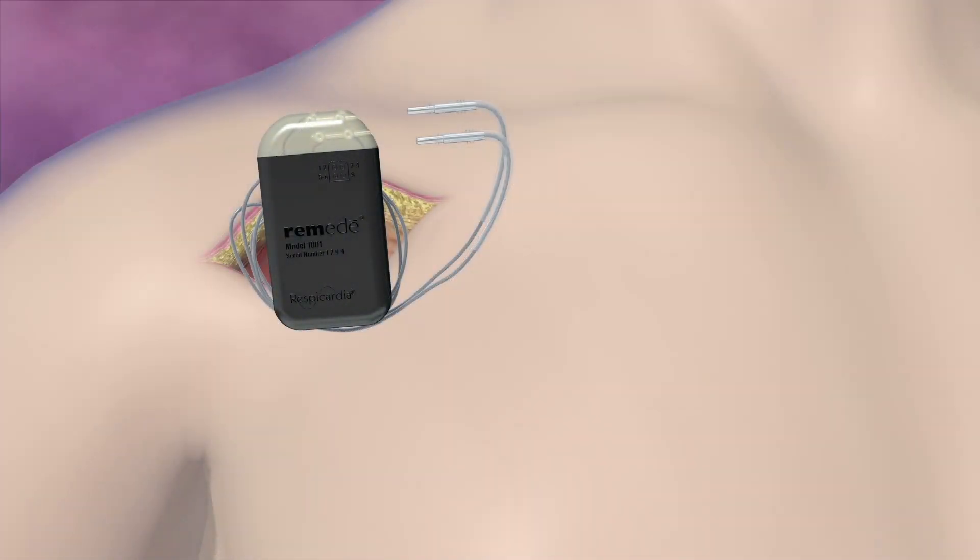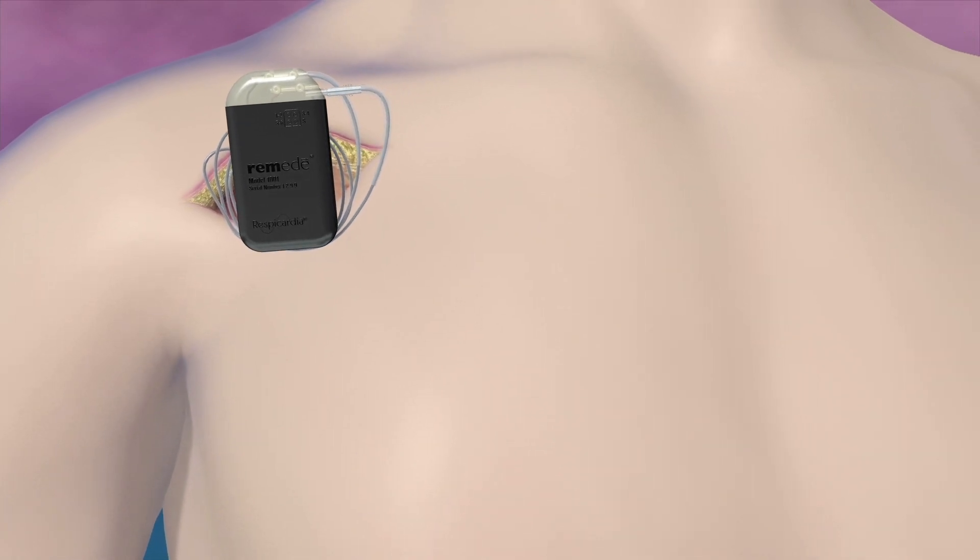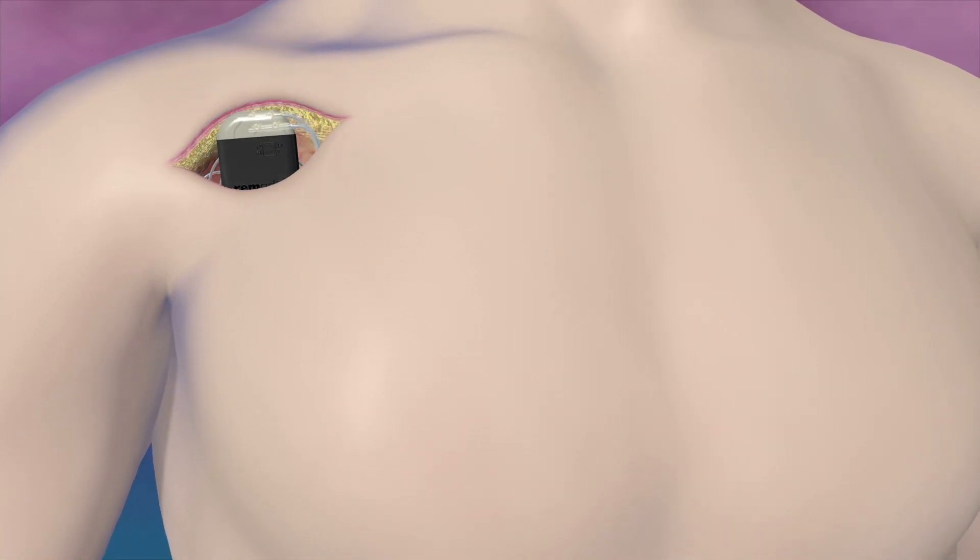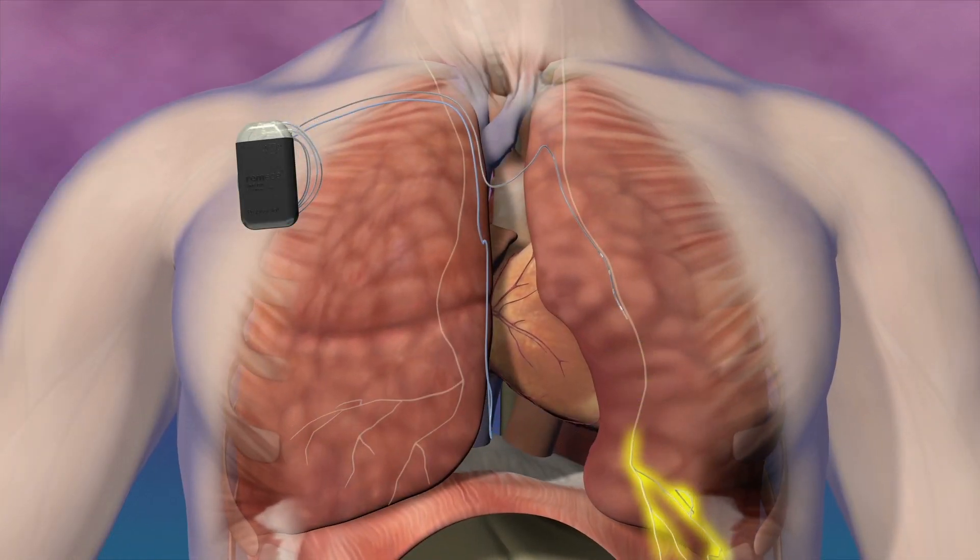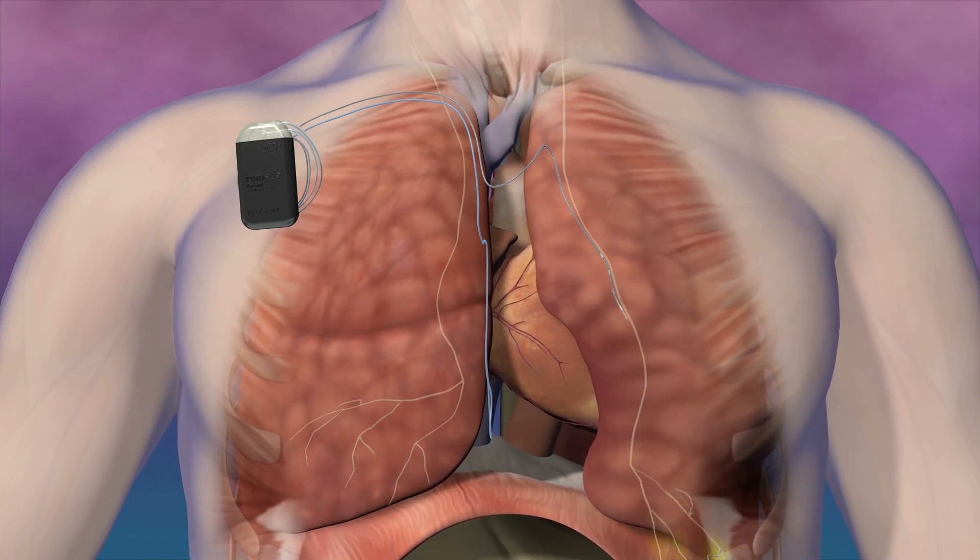The third step in the procedure is implanting the pulse generator. The stimulation lead and sensing lead are connected to the implantable pulse generator and inserted into a pocket. Final device programming is performed. This concludes the implant procedure of the Remedy System for the treatment of central sleep apnea.